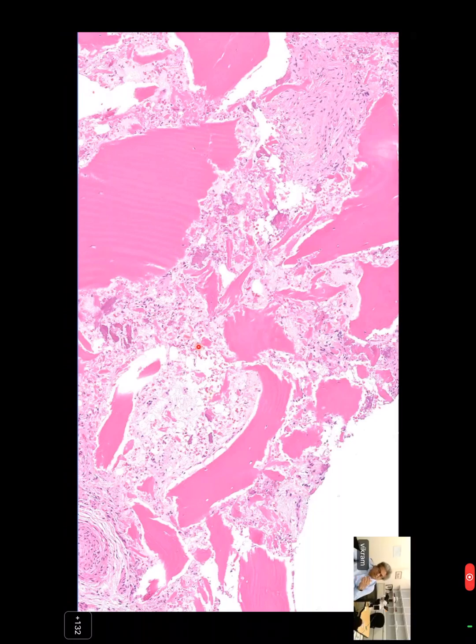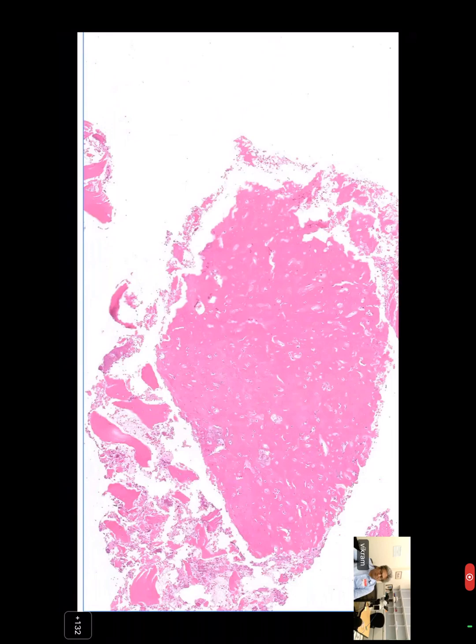The reason I emphasize this is that occasionally the radiologists will not quite capture the nidus of an osteoid osteoma, and remember, there's this very sclerotic reaction around an osteoid osteoma, so it's tough to get in there. So occasionally they just get the periphery, and people get trapped into calling this an osteoma. But remember, this is just bone dust, and this is just, as you pointed out, lamellar cortical bone. All right, so now I think we are in the lesion, right?